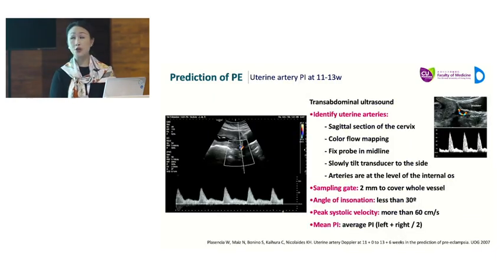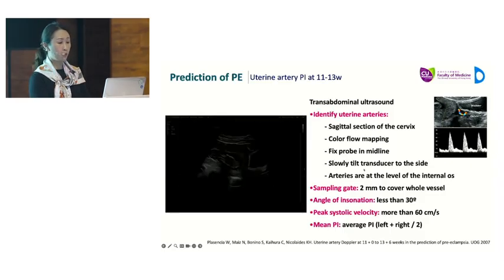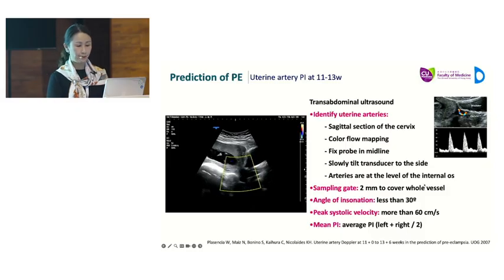Then in relation to ultrasound, of course, we're here at an ultrasound conference, and therefore we must emphasize the use of ultrasound. But I'm also mindful that the uterine artery Doppler may not be applicable in certain parts of the world, especially in Asia. Anyhow, we have a standardized protocol for measuring uterine artery Doppler through transabdominal ultrasound. I will not dwell on the methodology here, but you're welcome to take a picture of this protocol that has been endorsed by ISUOG as well.